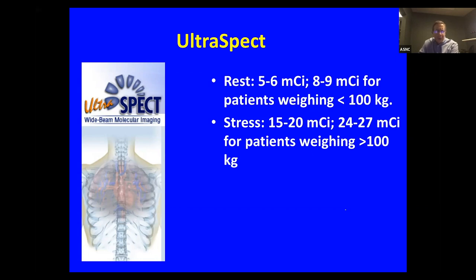Now, I didn't talk much about our new digital PET camera. It will take very heavy patients up to the weight limit of the table. We had been saying that above a BMI of 42 or 44, depending on the age of the generator, we preferred two-day SPECT studies over PET studies. Now that we have the digital PET camera, we rethink that, and actually the very obese patients, the super morbidly obese patients, can be scanned there very effectively also.